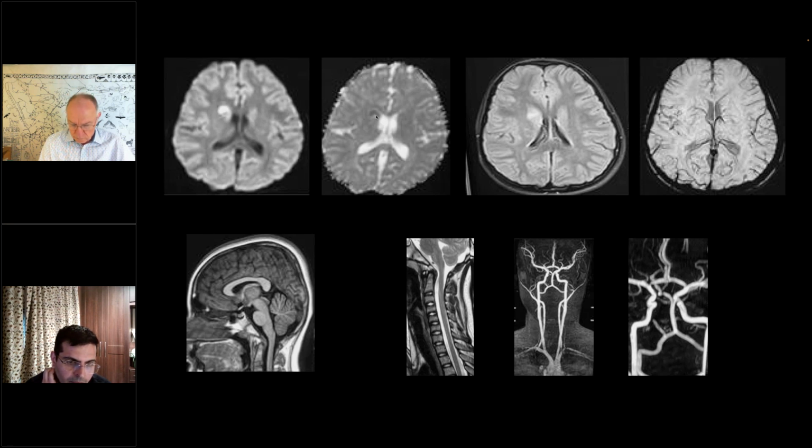She woke up in the morning, the scan was done around midday, 12 or something, and by 2 she was with us. There's a signal drop in the ADC. I could not appreciate a second abnormality. I think we will need the full scan to ascertain that; I don't think we can tell from one picture. Okay, fair enough.